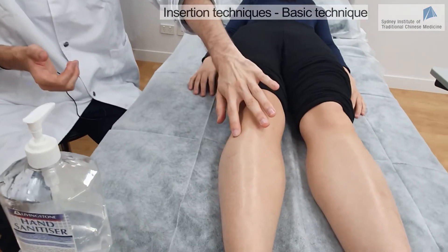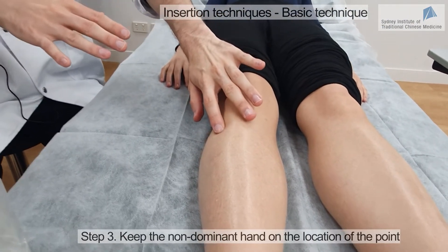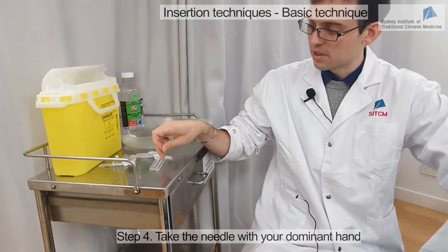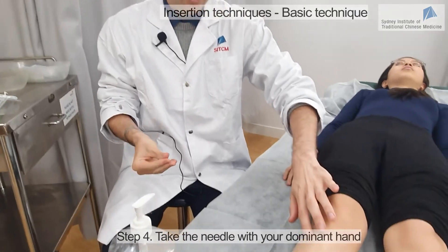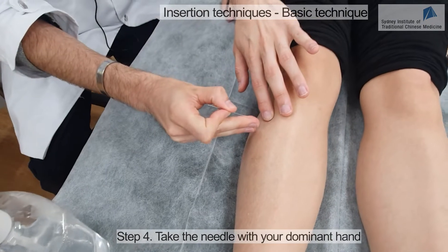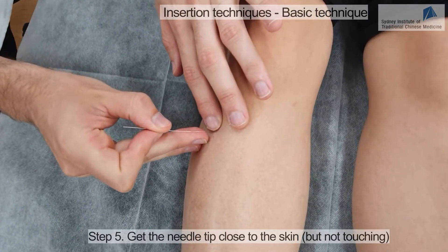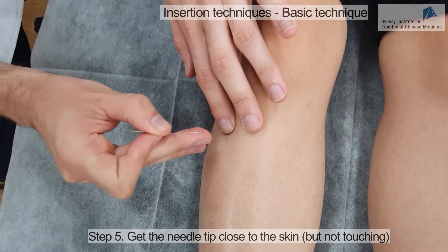Once you have the location, you can keep your second hand on the location of the point. You need to make sure the patient is in a comfortable position and that all your equipment is easily available. I need to be very close to the skin when I'm going to insert the needle, and the movement has to be very quick and swift so there is no pain when penetrating the skin.